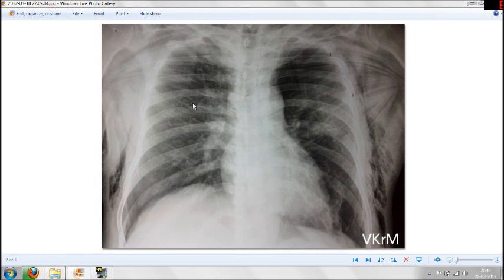Hi friends, this is a chest X-ray of a patient who came to our emergency department with complaints of chest pain on the left side and breathlessness. After the chest X-ray was done, you can see the difference here.